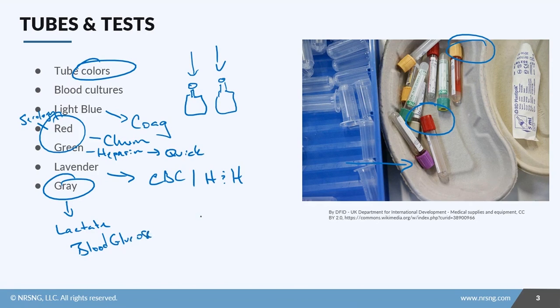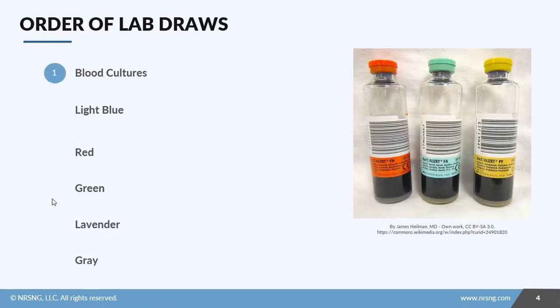One thing that I do want you to remember is that this is not a comprehensive list, and this is probably the most common types that you're going to see. But just check with your facility and talk to your lab if they have specifics that they want for specific types of tests for your patients.